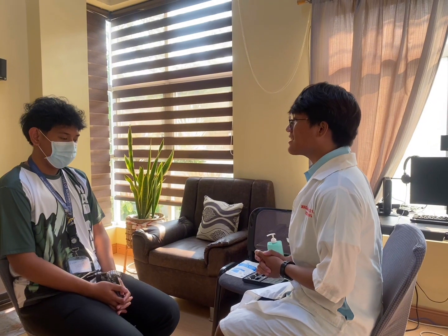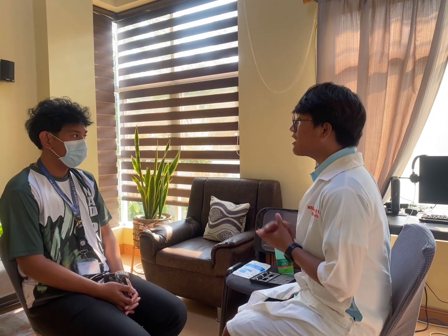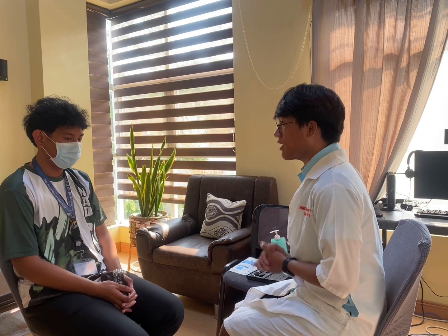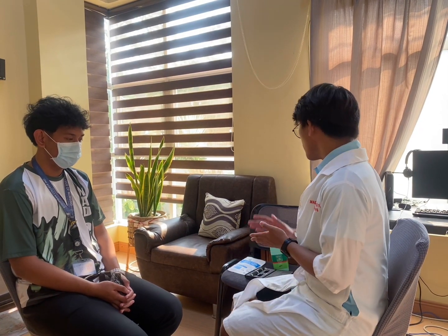And today I'll be assessing your ears. It's essential for monitoring your ear health. I'll use an otoscope with different specula sizes. I'll explain each step, why it's necessary, and how you can cooperate. Okay, first I'll be performing proper hand hygiene.